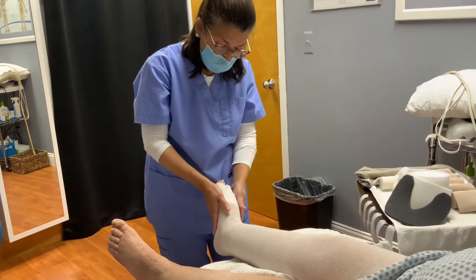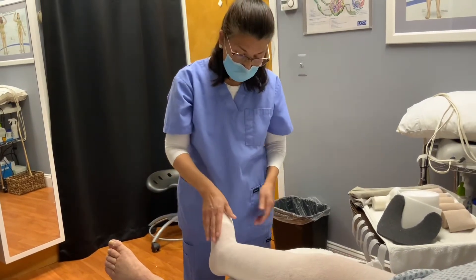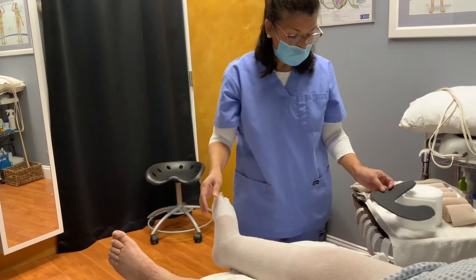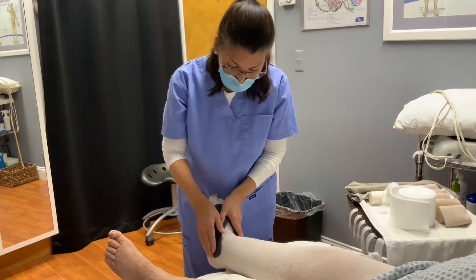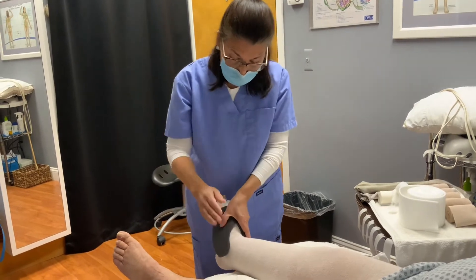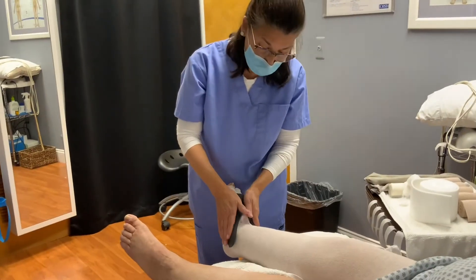With this patient, what we're going to do is apply some foam over the dorsum of the foot just to help break up some of the fibrosis. That's the purpose of foams — different textures and density help break up some of the fibrosis that can occur, which can trap the lymphatic fluid.